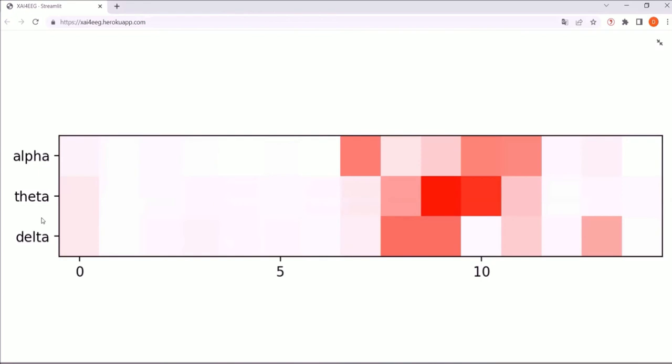We propose a novel flow of patterns to map the raw SHAP values to the explanation module. Hence, each of the 45 cells represents a spectral temporal EEG region holding the respective SHAP value and is colored in red, inspired by the idea of heat maps. The more intense the red, the more this spectral temporal region contributes to the final prediction.